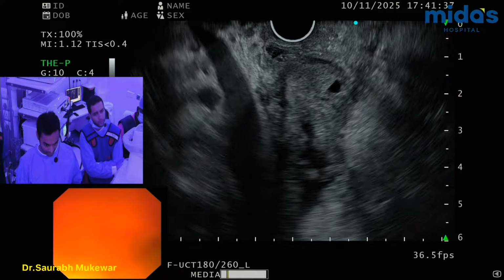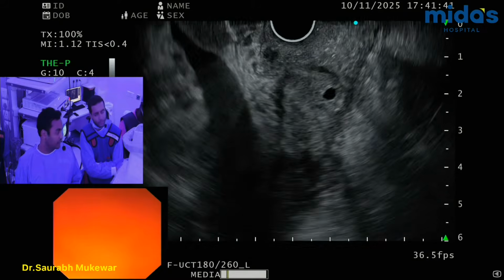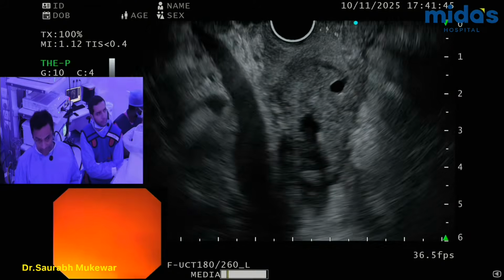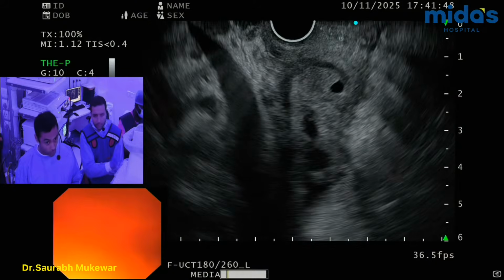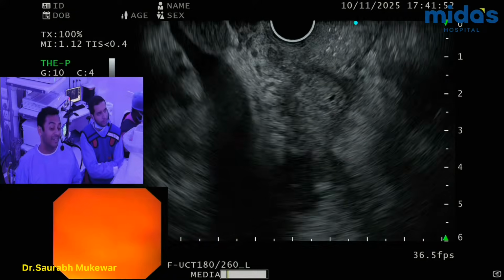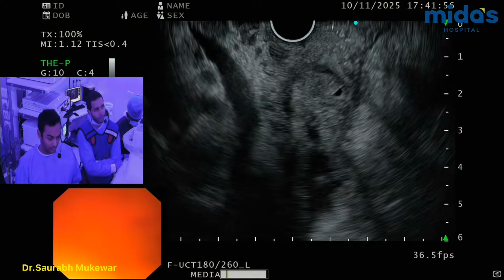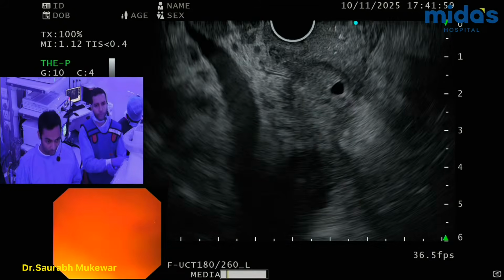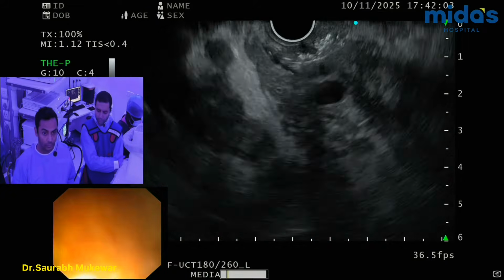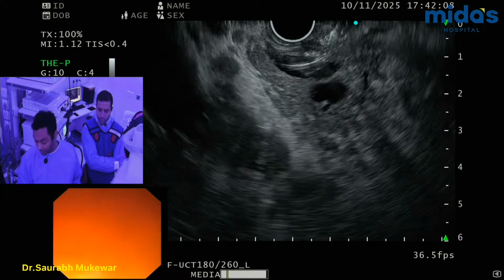Let's see. Yeah, so it's going to require nice. She has a deep wire in, so the wire is nice and deep, which is good because she's going to give me a lot of negative traction while I'm going to get across that part over there. You see that sharp angle? Yeah. That's going to be my main task. Once I'm above it, then I'm good to go. Quick, listen, fast. Okay.